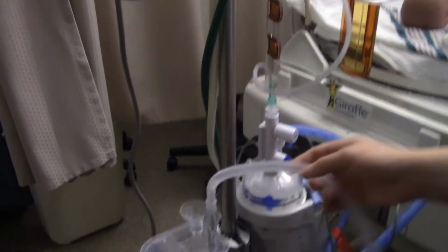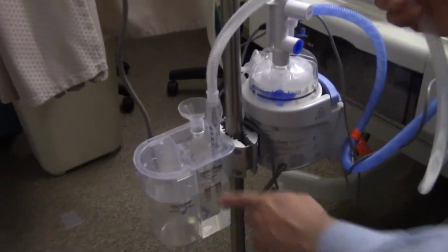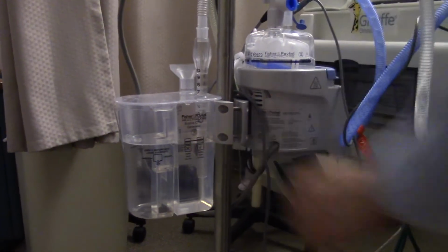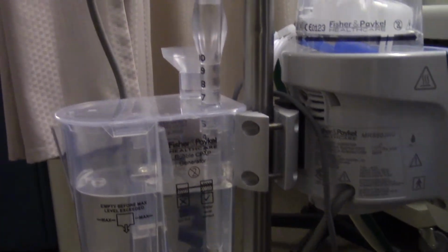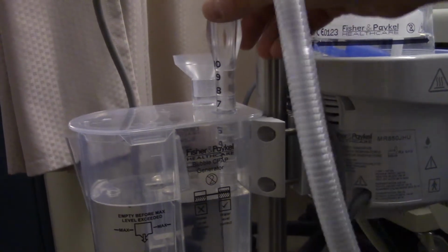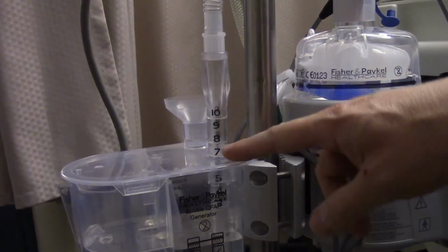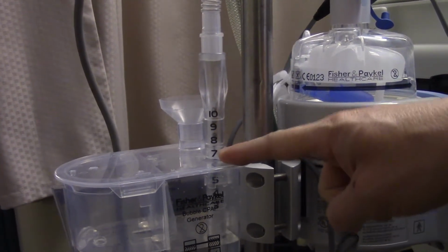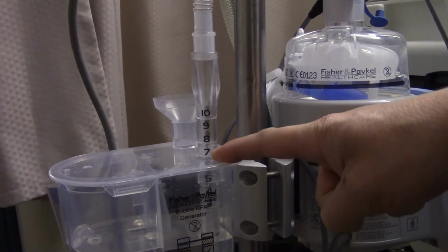And down here on the bottom, you see the bubble chamber itself, and there's sterile water that goes inside of this. It goes up to the fill line right here. Turning this on, you'll see bubbling in the chamber, and we'll demonstrate that here in a little bit. The other key thing to note on the setup is this part here that goes down into the water, which is what's actually creating the pressure. Whatever number you see protruding through the top of this chamber is what the CPAP is set to.